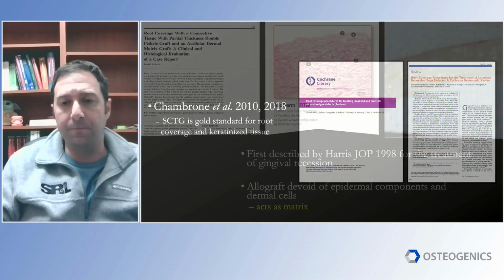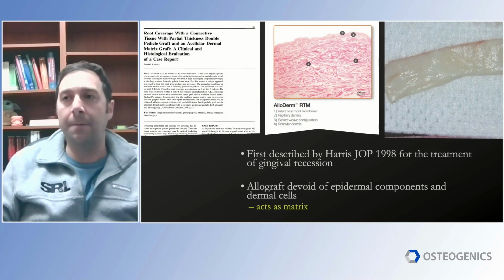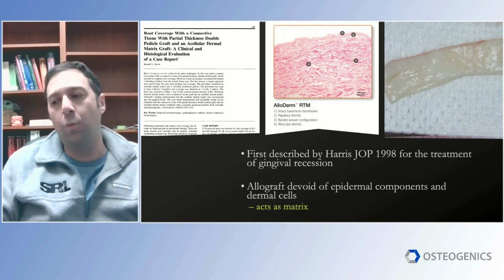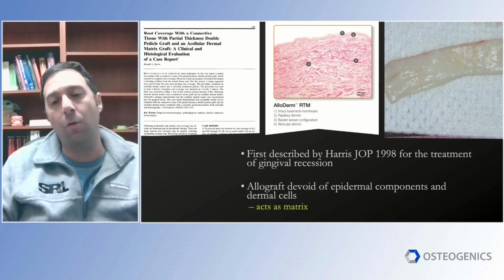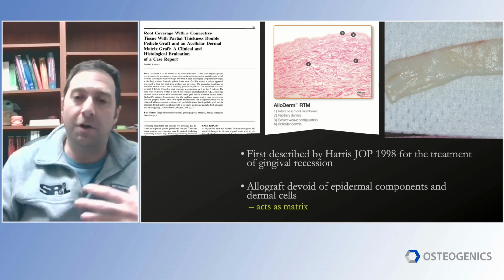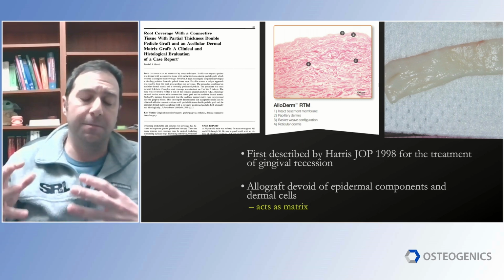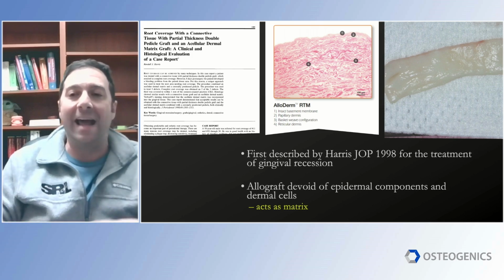and membranes. But what happens when patients come to your office and they really don't want to use their own tissue, mainly because they've heard horror stories about how you have to harvest that tissue? Well, we do have good alternatives. The main alternative that we give to patients, we give as an option, is an allograft tissue.